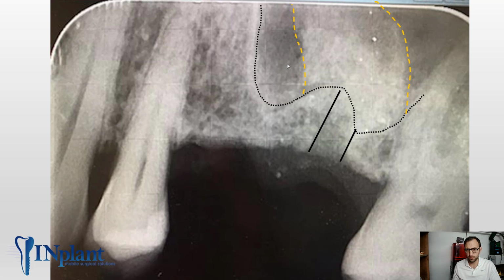But what was the stress point that caused that tear? So that happened really as the crestal floor kind of dips down and the membrane is trying to lift up. That's where it's going to hit its snag, and it's not going to want to lift. The point of least resistance is no longer going to be the membrane lifting off the floor. It's now going to be the top of the membrane tearing open. So how do we avoid that?